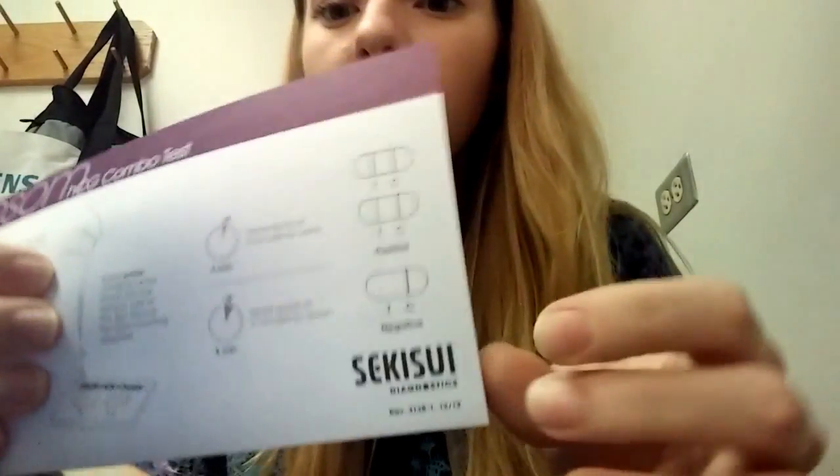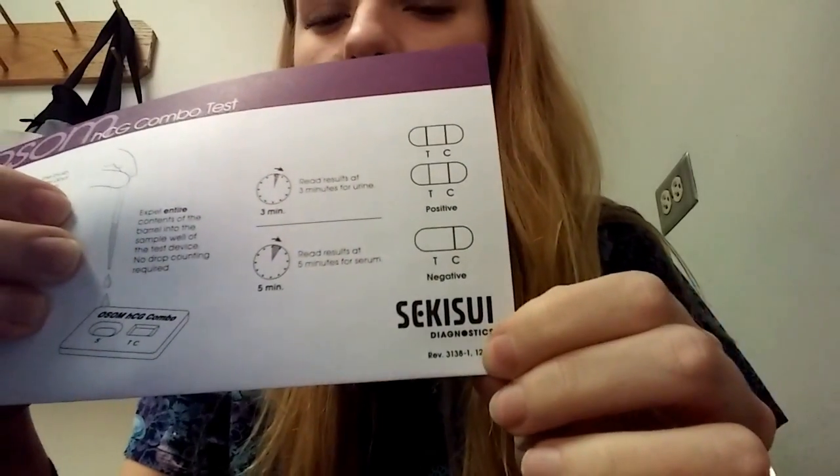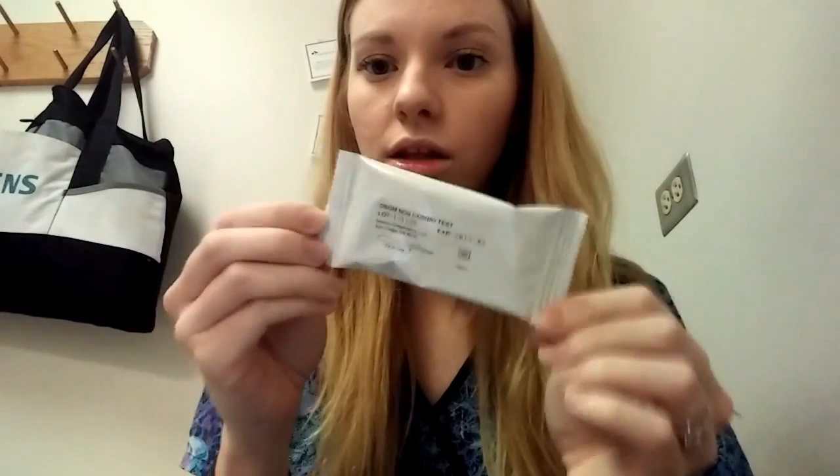This is what the little package looks like. You will just rip this open — it comes with the pipette to add the sample, either the serum or the urine, and then it comes with the cartridge.